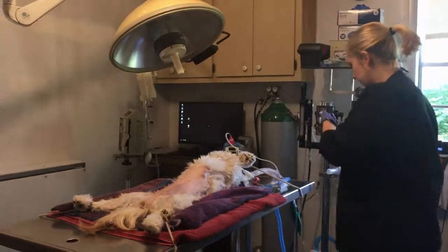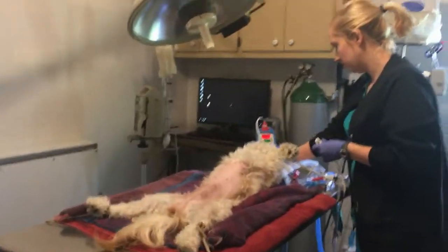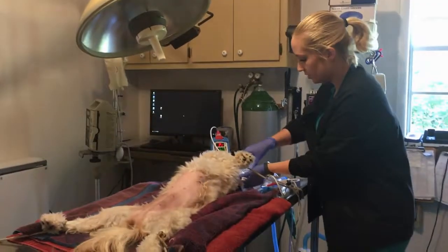And I'm going to be attaching the end clip to her tongue. Go ahead and moisten her tongue a bit.